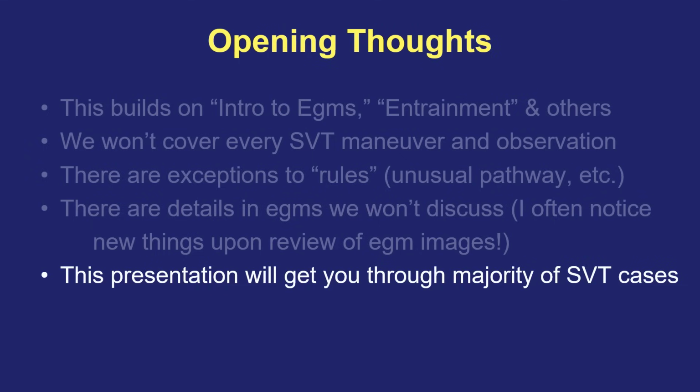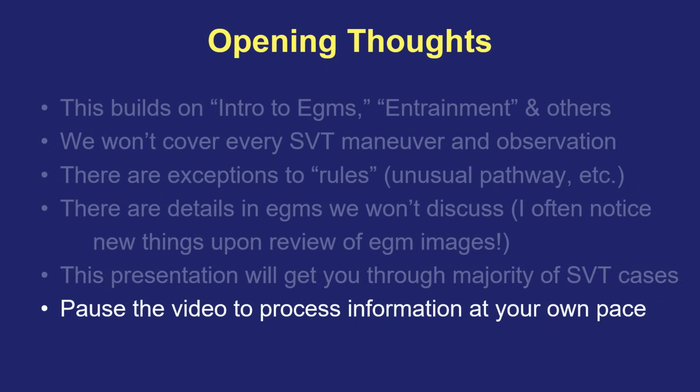Again, this presentation will get you through the vast majority of SVT cases that you'll encounter, although perhaps not every single one. There are always complex cases where some of the rules are broken, or there are conflicting maneuvers that you'll do, giving you different answers. And so if you go through SVT cases in a very methodical way, do all the maneuvers, you should be able to get an answer using the tools that we'll discuss in this presentation.